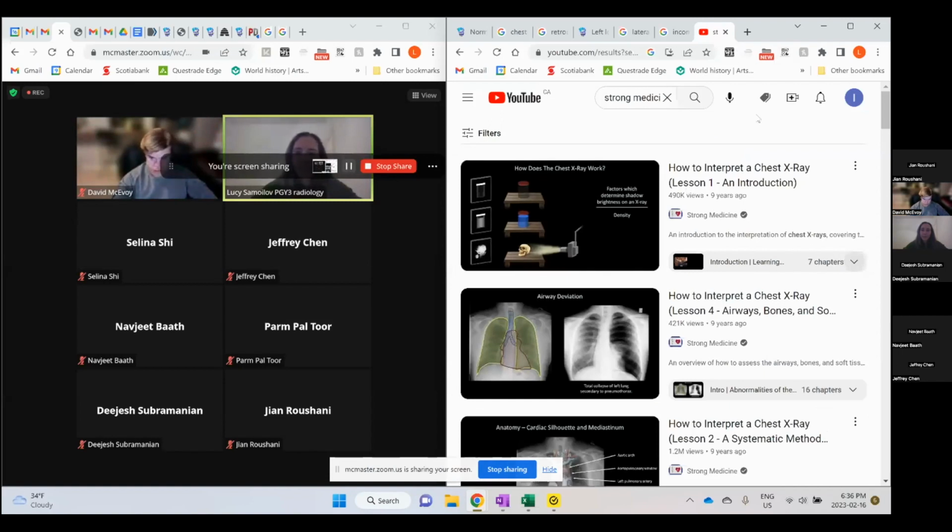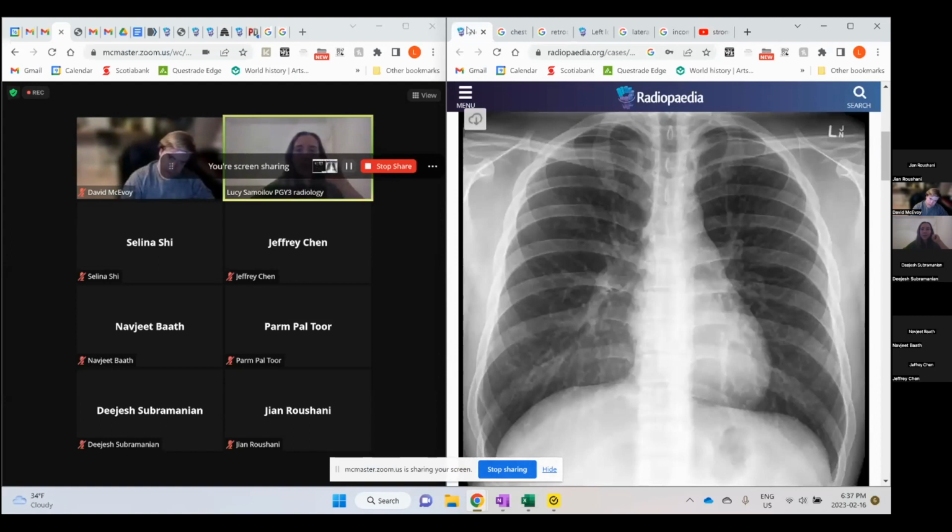Yeah, and I think try to get more experience under your belt, because for me, it's easy to see an abnormality because I already have a reference standard in my head from looking at hundreds of x-rays. That's the best thing to do to build your sense of normal and abnormal, because otherwise it's very hard to detect an abnormality if you don't have a normal to compare it to.